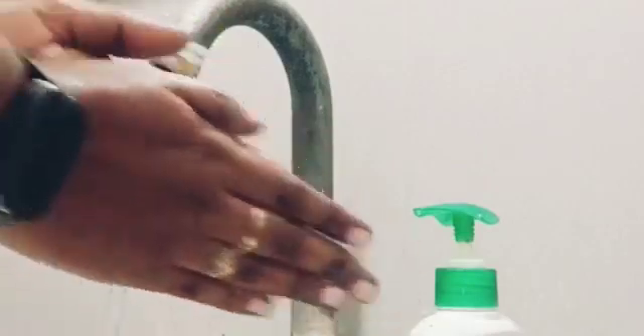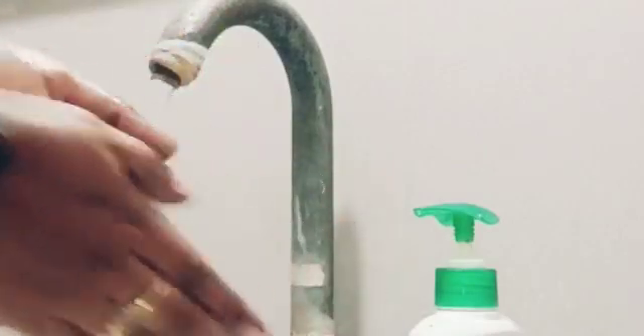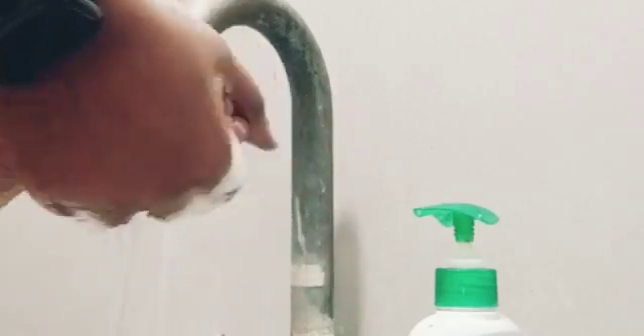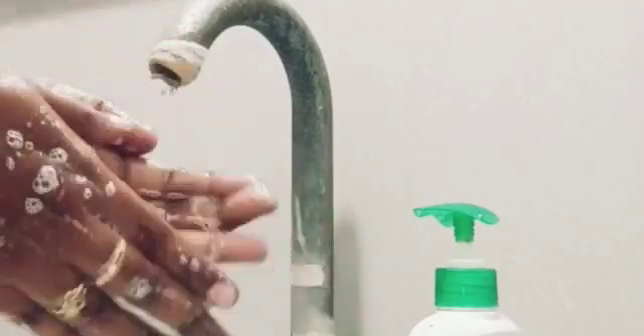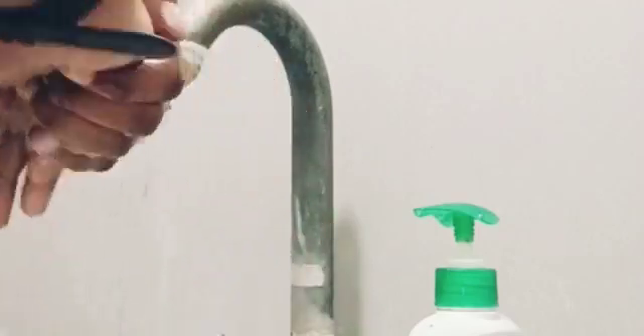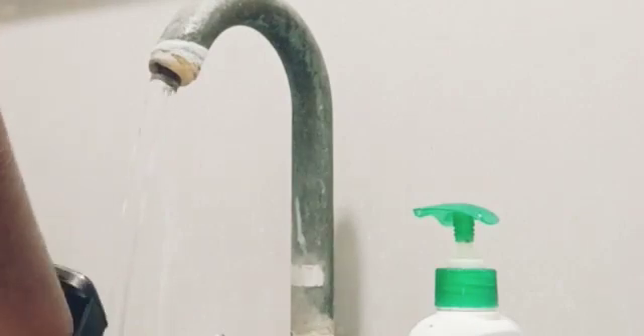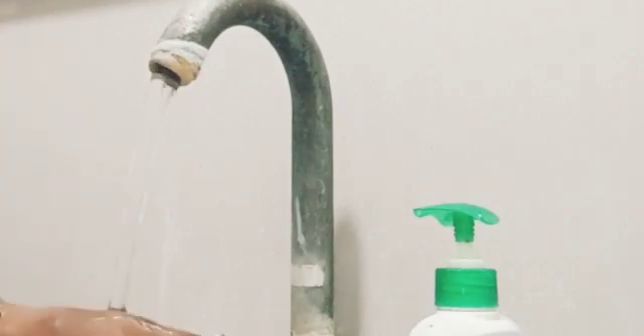Before inserting the contact lens into the eye, the first step we have to do is hand washing. We should wash our hands with soap and water. We should not use soap that contains lotion, cream, perfume, or artificial coloring. After washing our hands, we have to dry our hands with a lint-free towel.